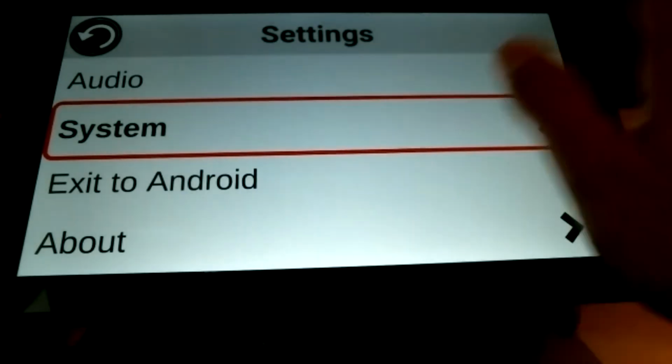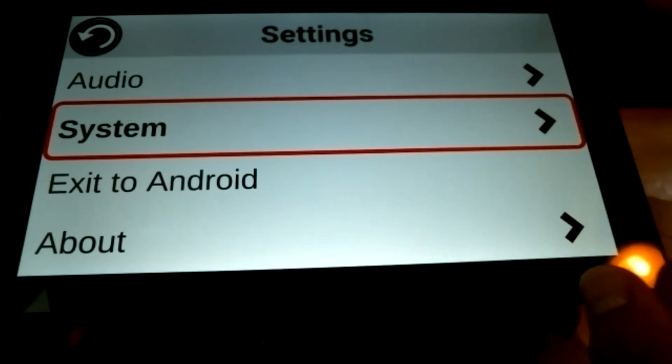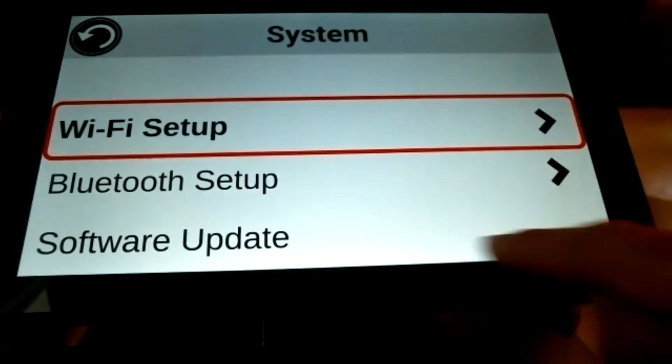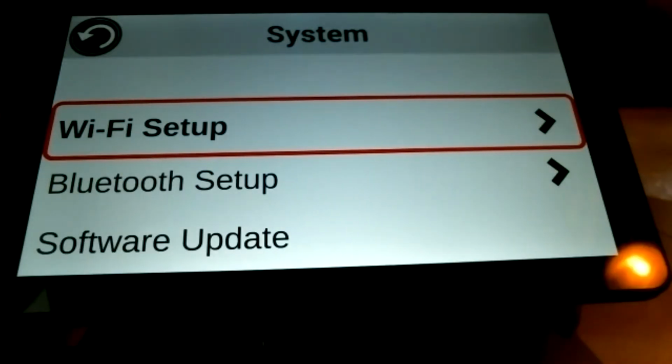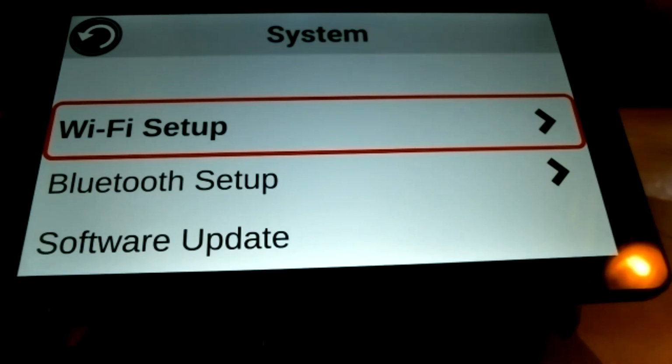So if I click anywhere on the screen, it's going to activate that system menu. So if I click here at the bottom, I'm still going into system. This is for very low vision users where I don't know where the options are and I'm unable to click on the right option. So the locator shows you which option is going to be read out and which option is going to be activated when I tap on the screen.